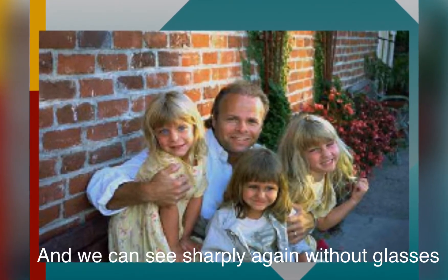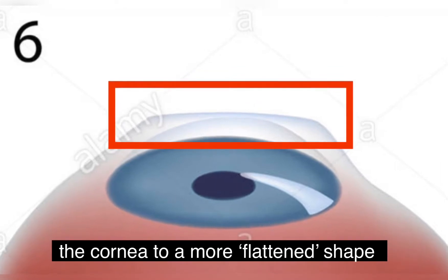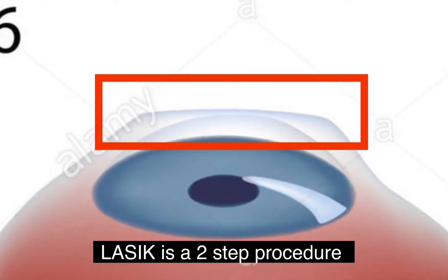How do we achieve this? We achieve this by altering the surface of the cornea. By flattening the curvature of the front of the cornea, we are able to refocus the image on the retina.